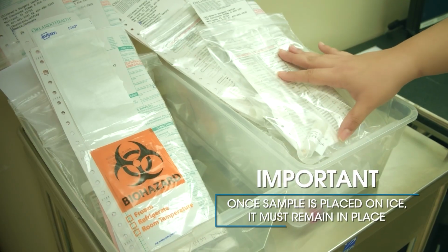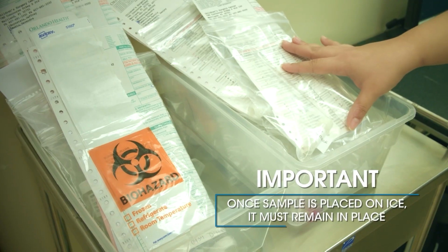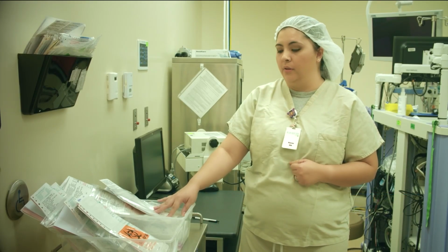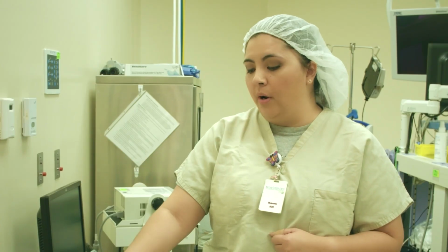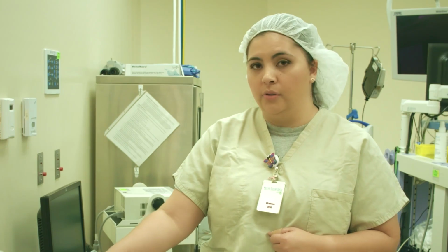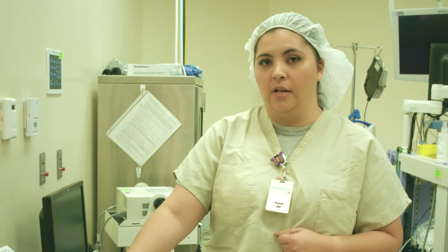Once this specimen is placed on ice, it must remain frozen for the entire time during transportation and arrival to the lab. We keep it on wet ice until we get a courier that has dry ice available to us, and from there it's transported frozen.